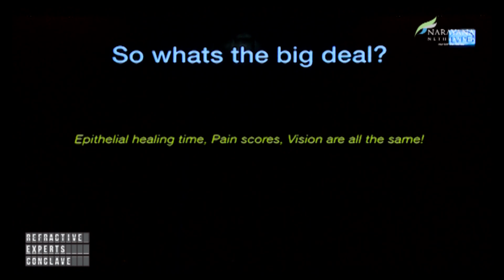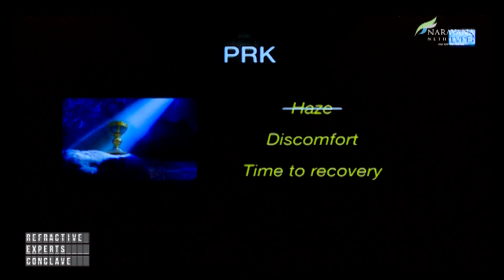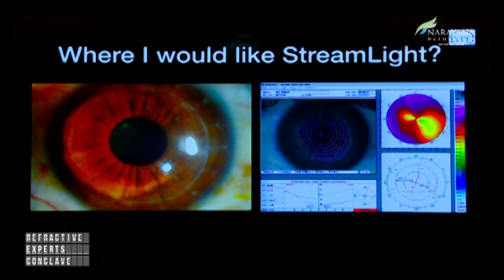It's good that the refractive results and all of these are the same, at least they're not inferior to what was already existing, because that was one of my fears when I was fearing refractive overcorrections in these patients. So, we still have to worry about two of the major issues with PRK, that is discomfort and time to recovery. They're still about the same. We've solved the haze issue with the mitomycin C. But then in the future, I think we could look forward to a few more things from StreamLight.